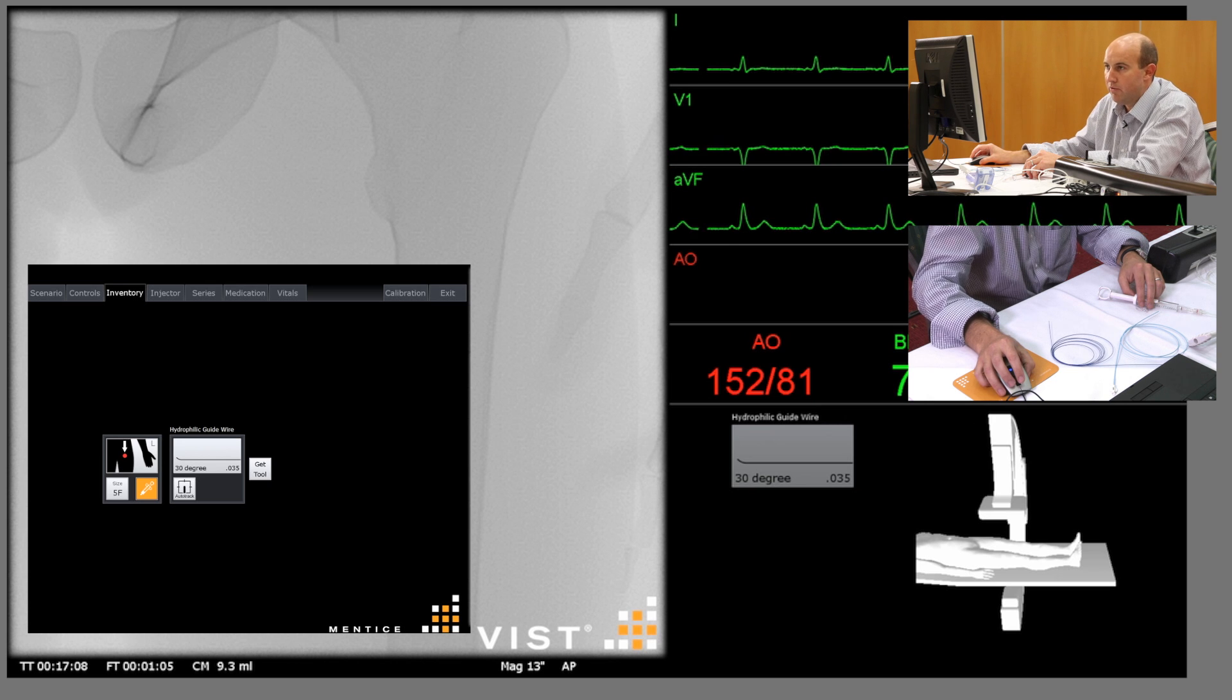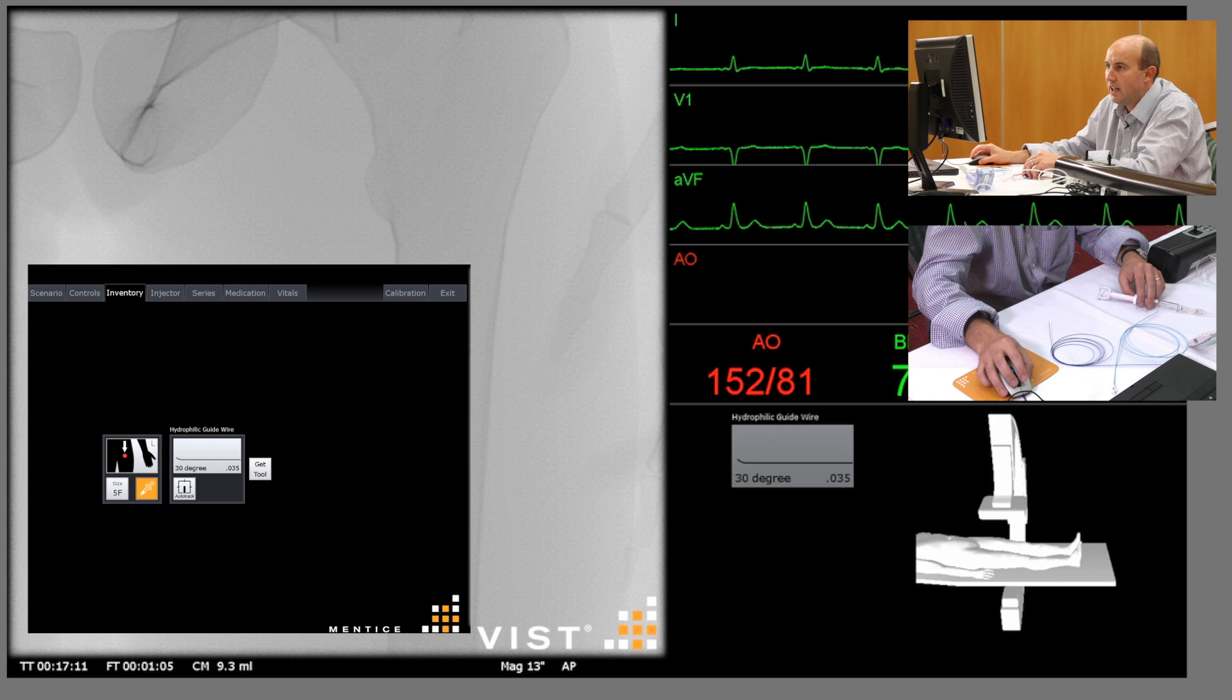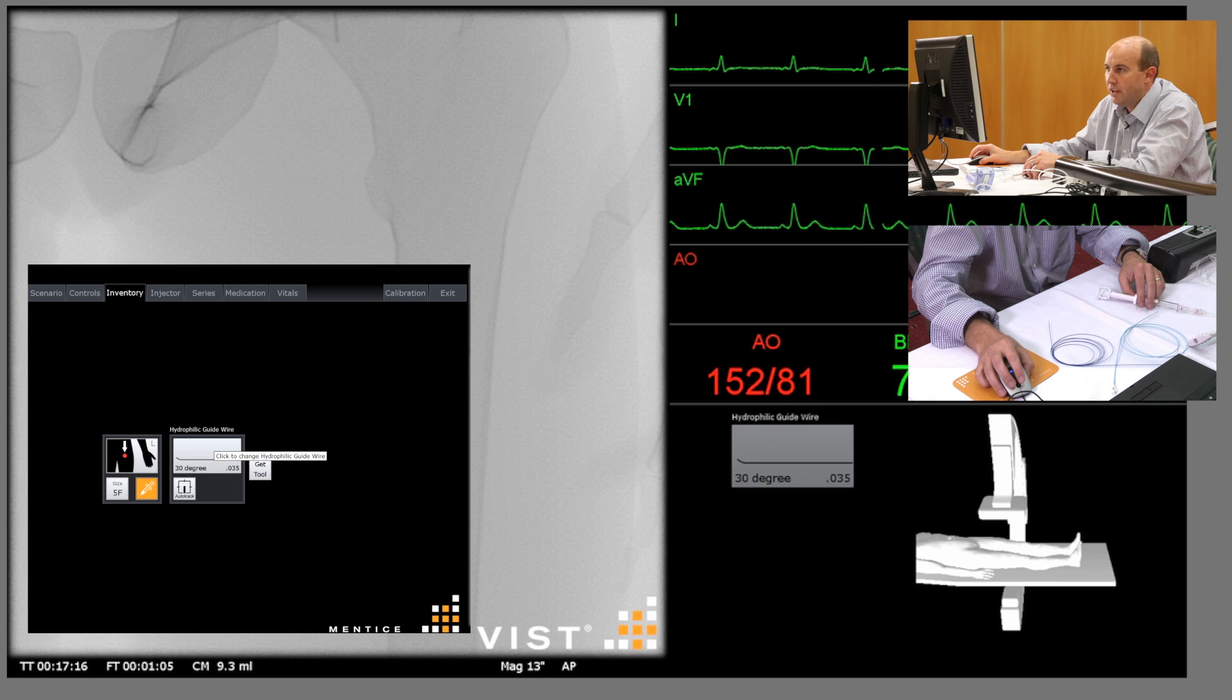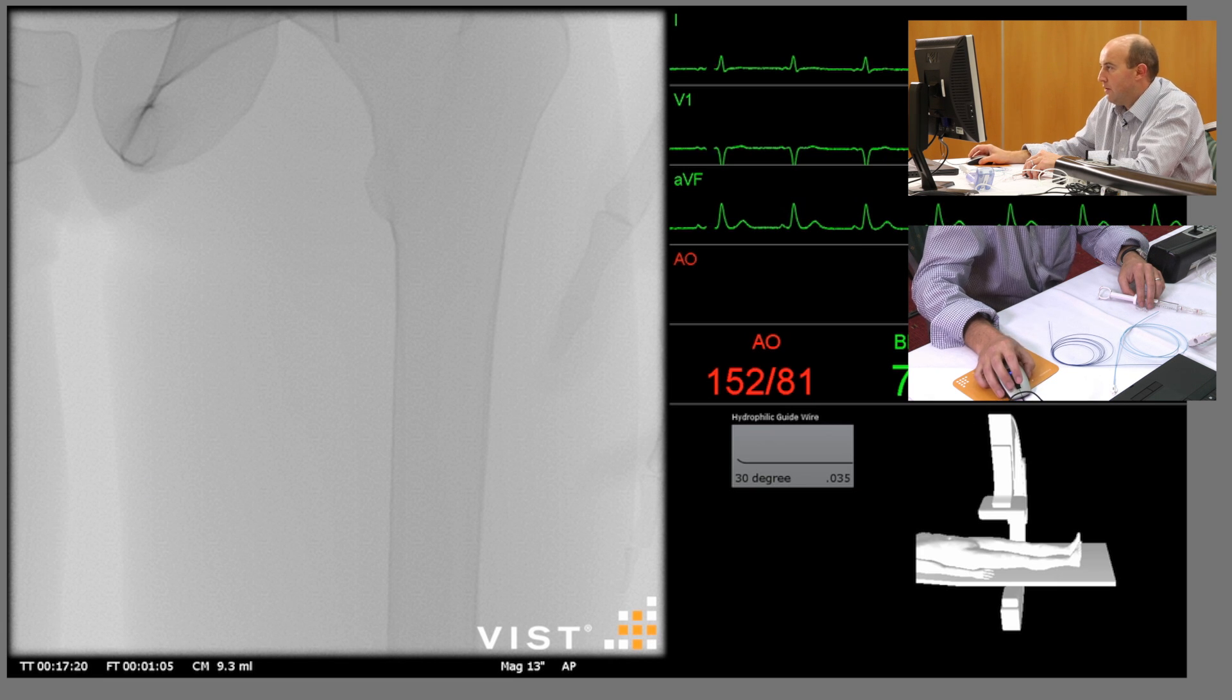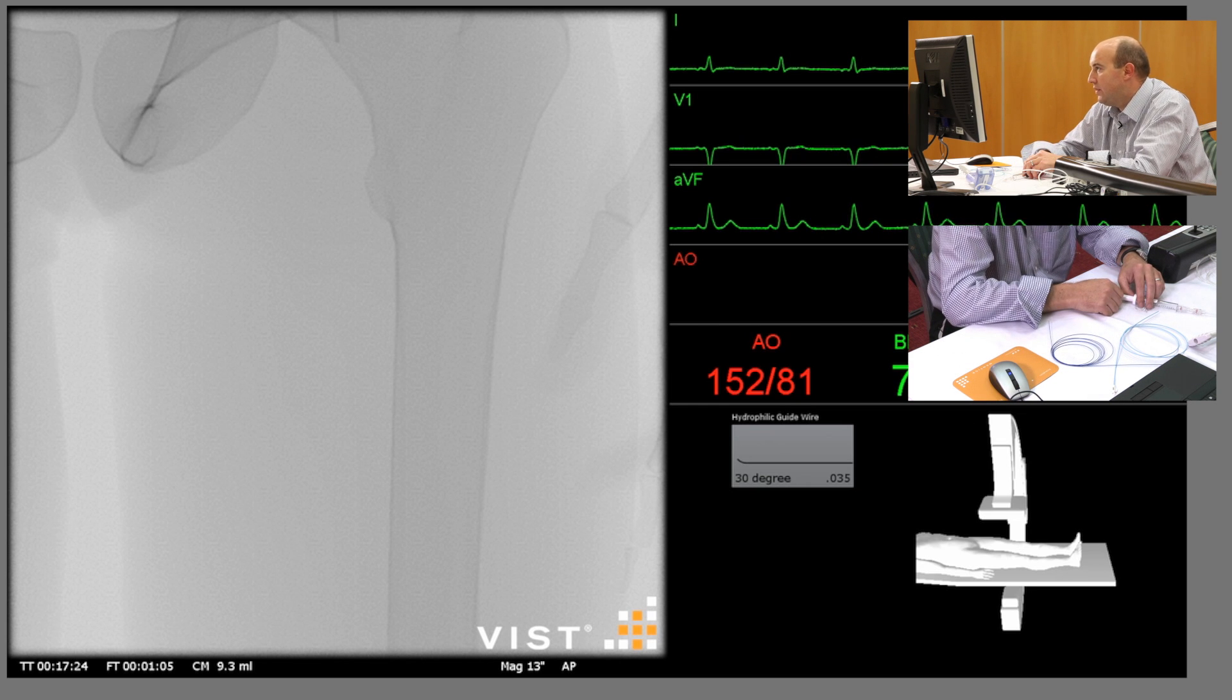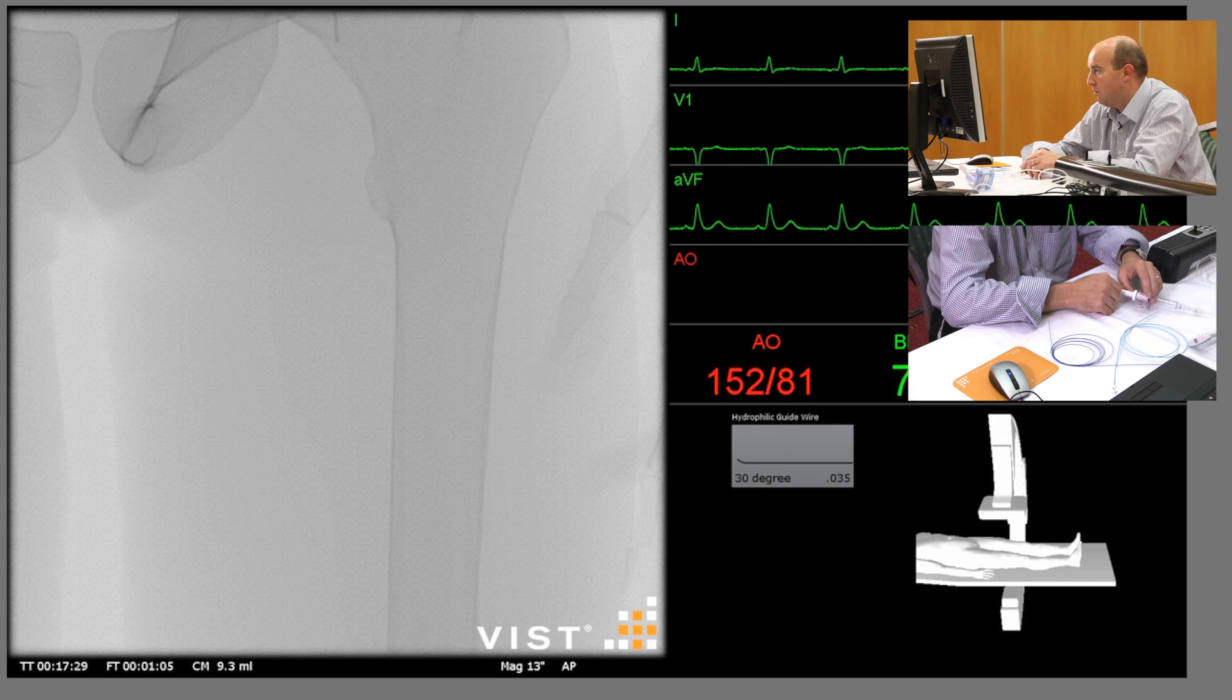We've also pre-selected an appropriate wire which would be an O35 angled hydrophilic wire. If we go to the active screen on the left, we can see the tip of the sheath in the top of the middle of the screen and the left common femoral artery.